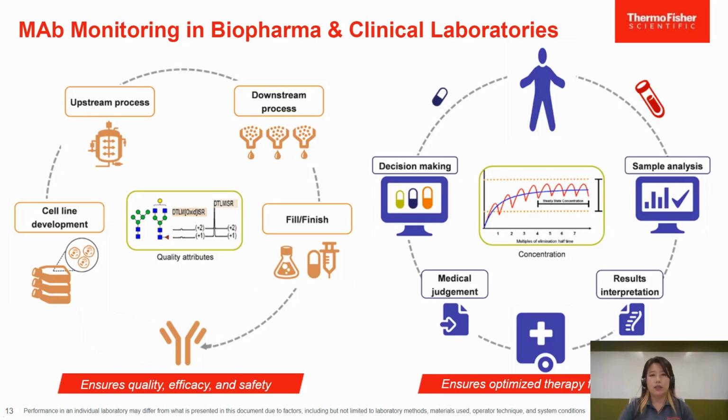After the drugs are manufactured and administered to the patients, clinical laboratories measure the concentration. The samples are collected, for example blood, and then the drug concentration is measured to make sure it is within the therapeutic range at steady state.